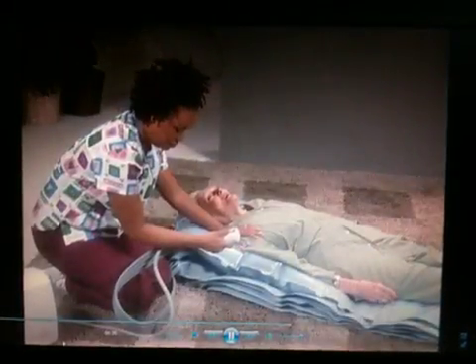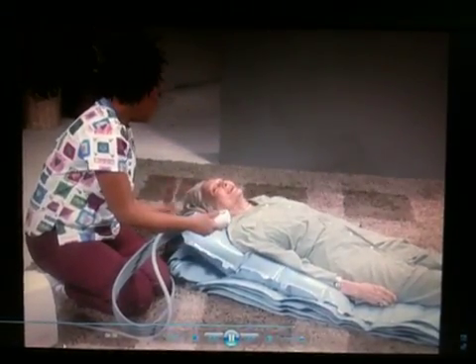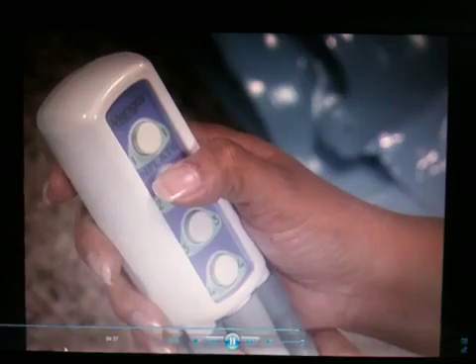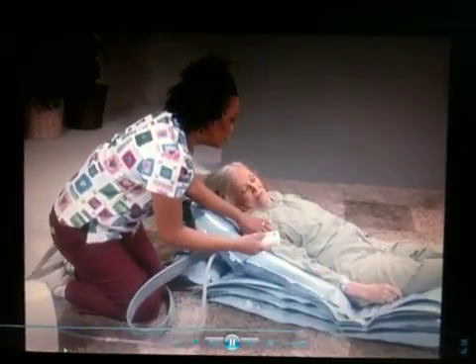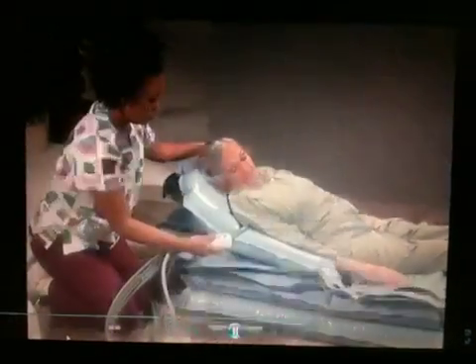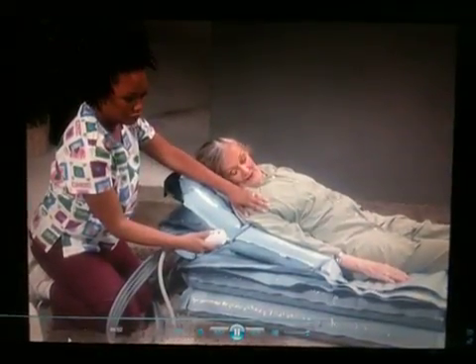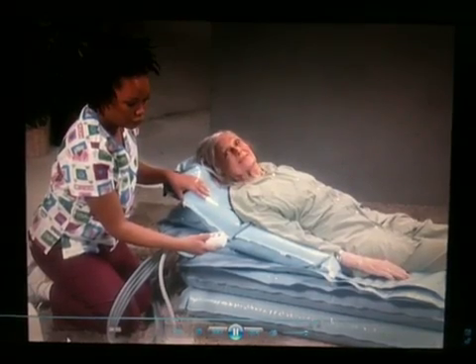This section should be inflated just enough to make breathing easier and to provide head and neck support for the person. Then the caregiver pushes button number 2 to inflate the 2 lower sections concurrently, providing a rigid base. This button is held down longer than the others because 2 sections are being inflated at once. Buttons 2, 3, and 4 are held until the compressor automatically senses that the section is full and stops.